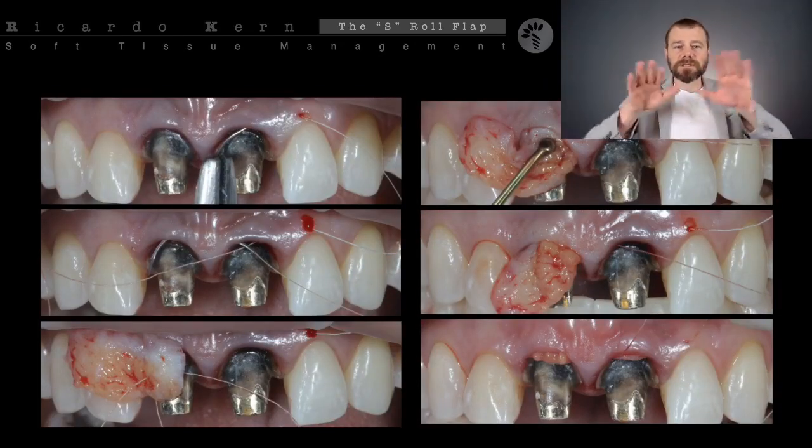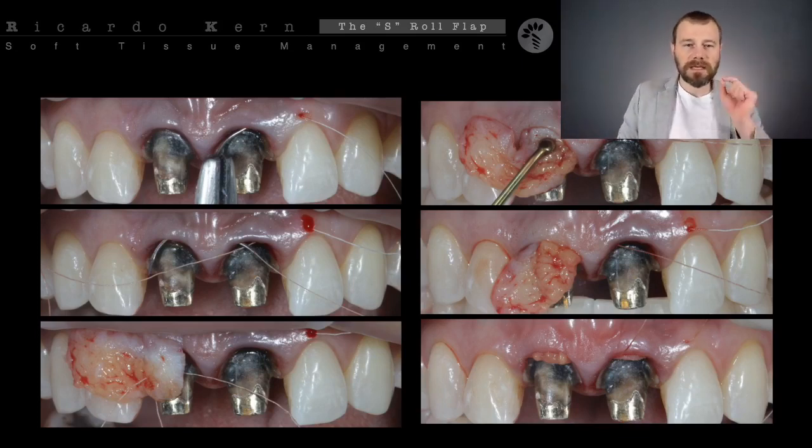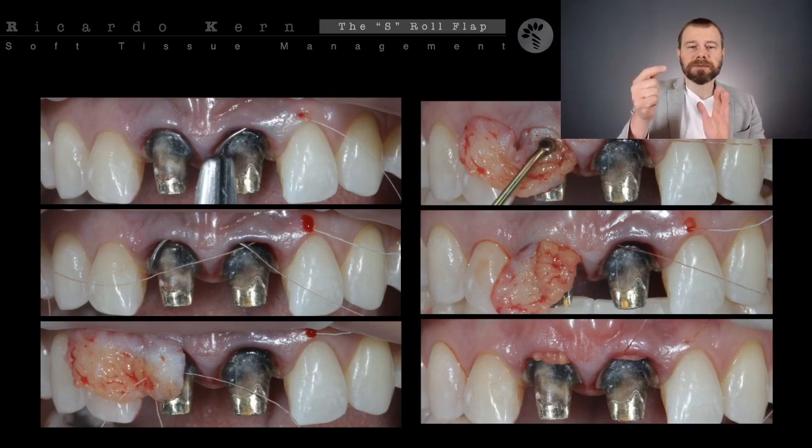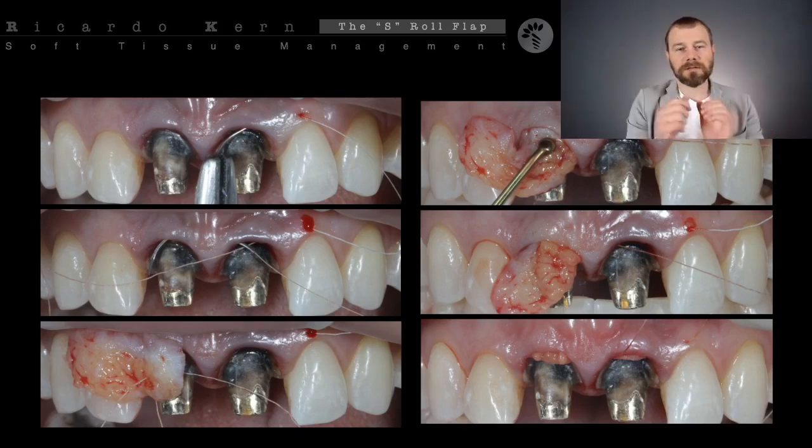So we just have the tunneling, and now we're going to bring the connective tissue inside this place, okay? And I'm going to bring the connective tissue with the sutures in place. So I have here on the first part of this slide my anchorage point, okay? The area where I'm really going to bring the connective tissue.